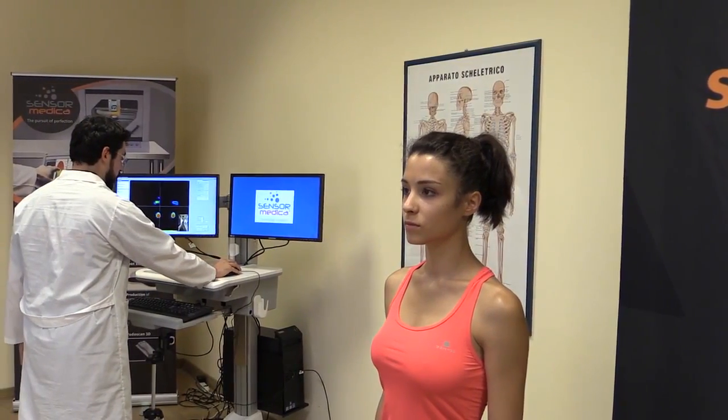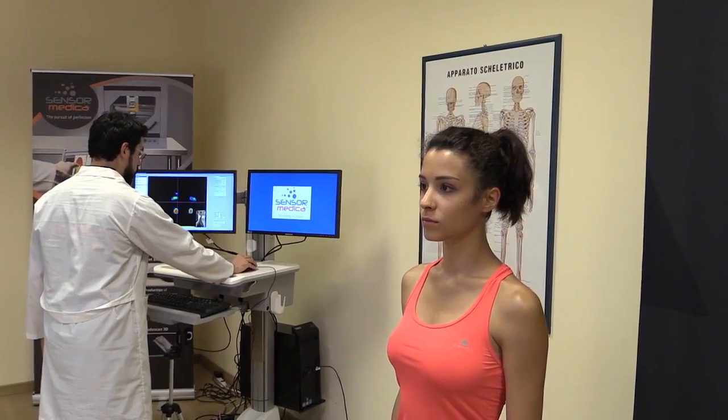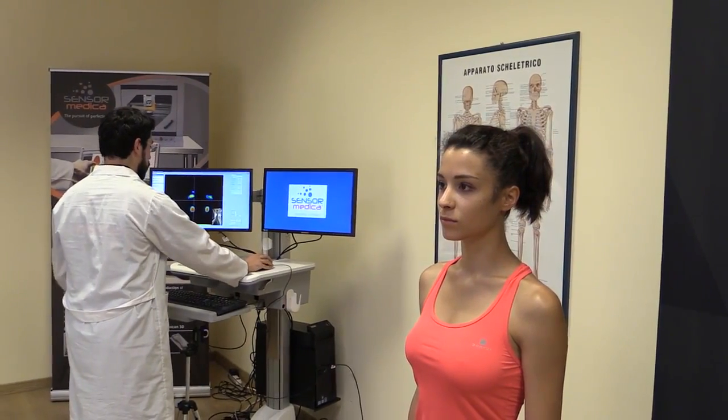An unusual and interesting application of videography during the static baropodometric analysis is the possibility to acquire some foot details in order to collect information on the geometric positioning of the foot, or to acquire some chest details in order to have qualitative information on the positioning of the upper segments. Now we can close the acquisition and the test will be automatically saved in the database.